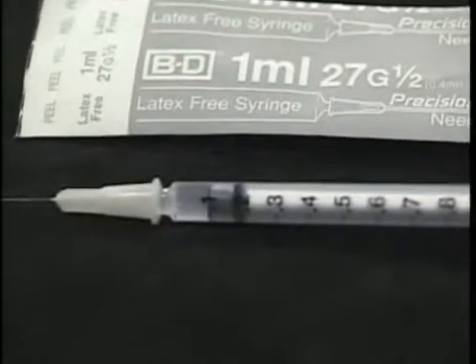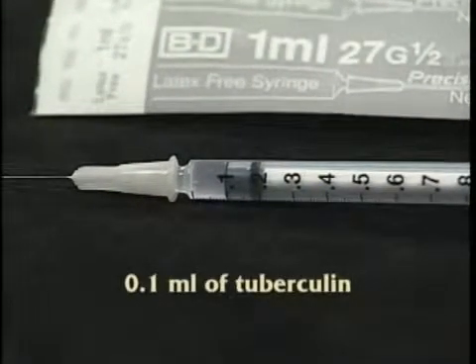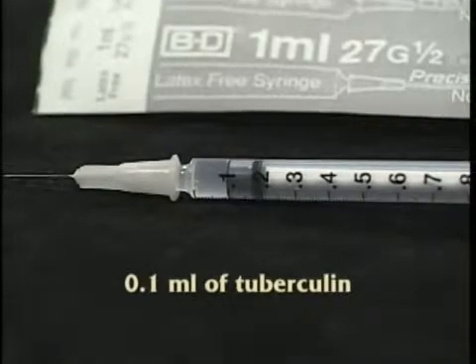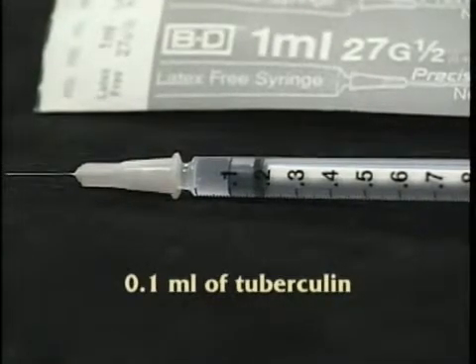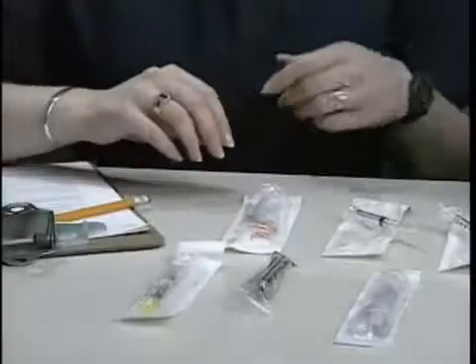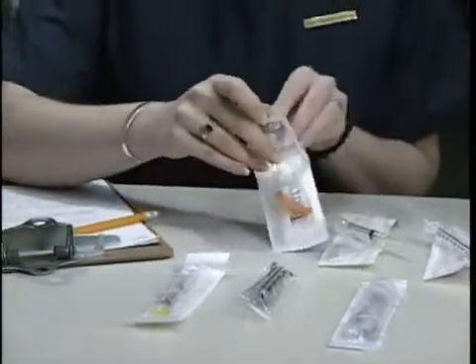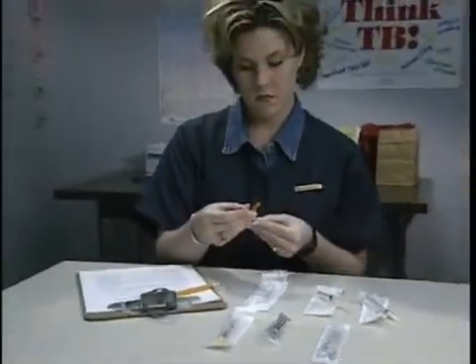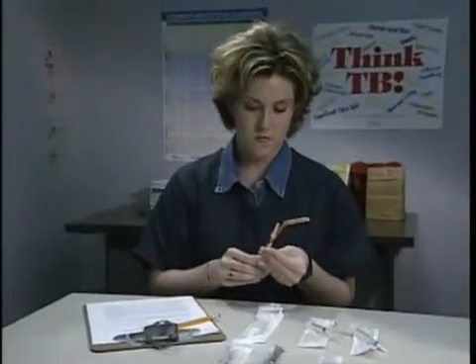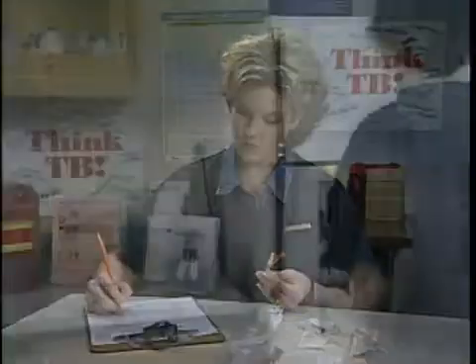In the United States, the Mantoux tuberculin skin test consists of an intradermal injection of exactly 1/10 of a milliliter, which contains 5 tuberculin units. Syringe and needle technologies continue to evolve to help prevent needle stick injuries. Institutional policy should determine which skin test device has been evaluated and approved for use by your facility.